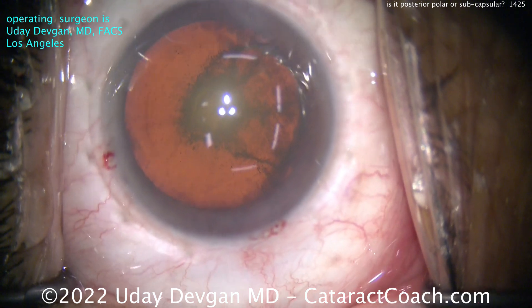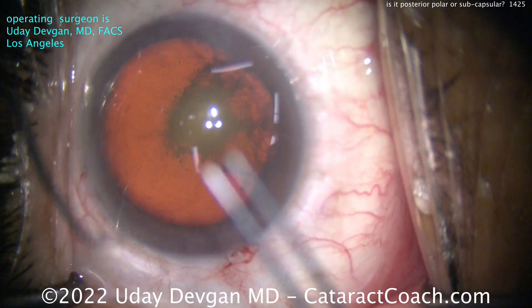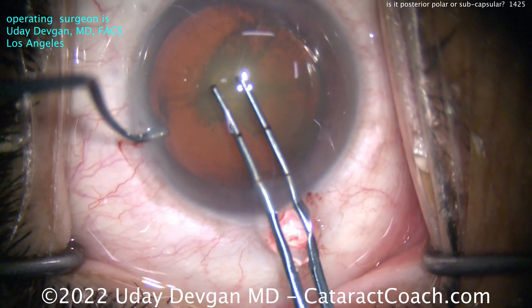Did you decide yet? Is it posterior polar or PSC? You know you have to figure this out — because what do you do? Are you going to do hydrodissection like a normal case, or are you going to do just hydrodelineation and viscodissection?